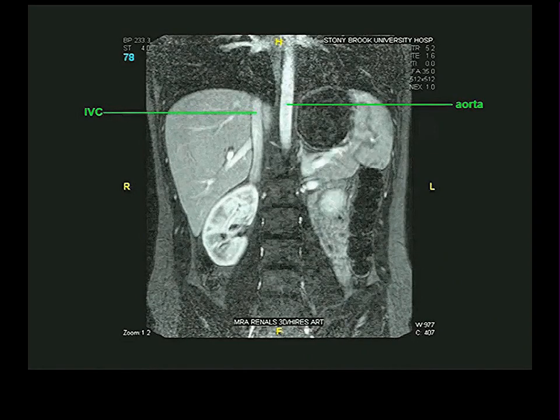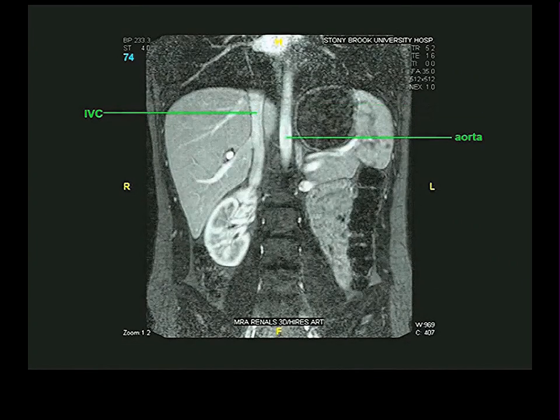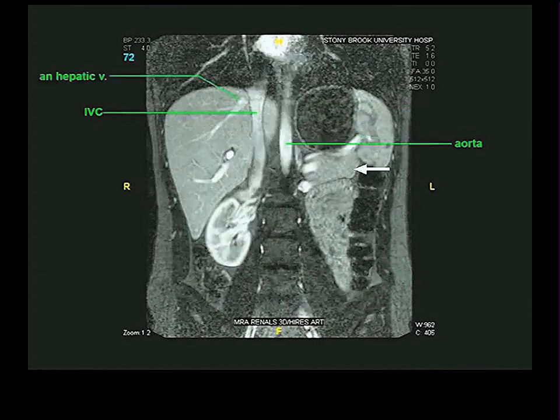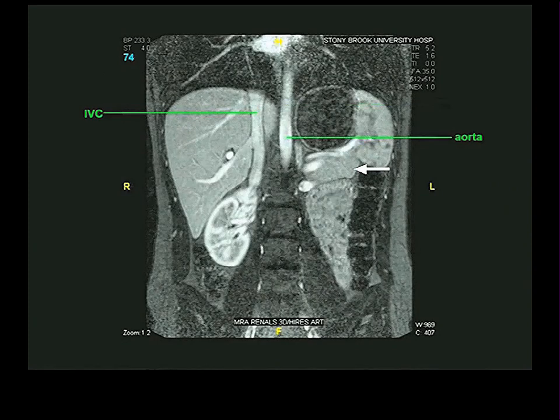We come forward again. We've already lost our left kidney by this time. The person's left kidney is either small or very posterior. Come forward again. Forward again. Nothing of great interest. You know, we see something of great interest right here.